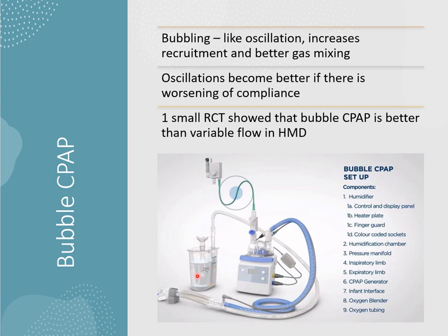This is the let out. So water is filled here. So this is the basic setup of the bubble CPAP. I'm sure all of you are aware.